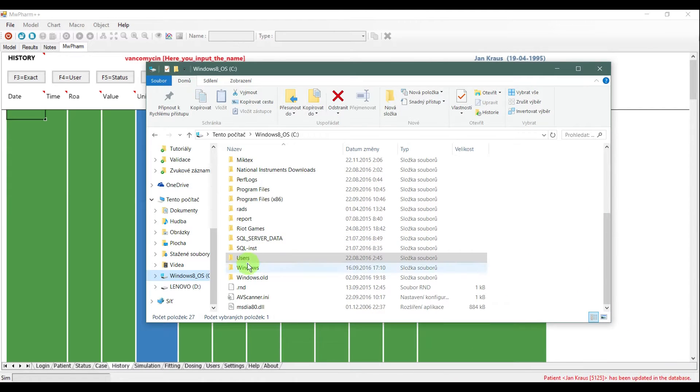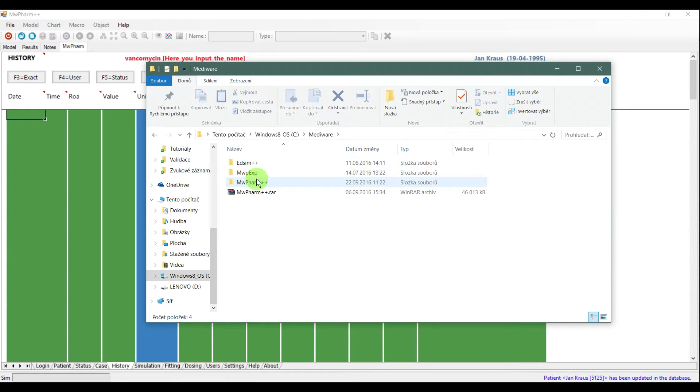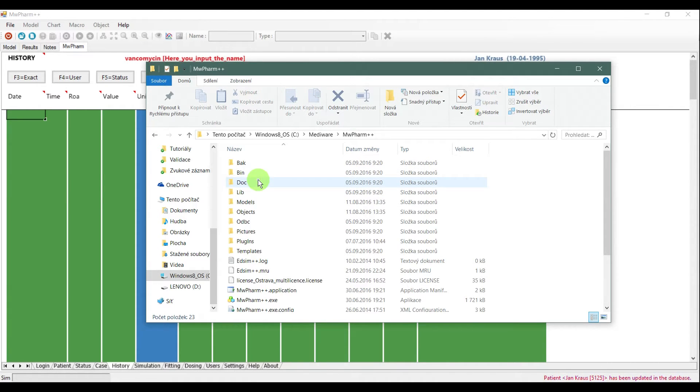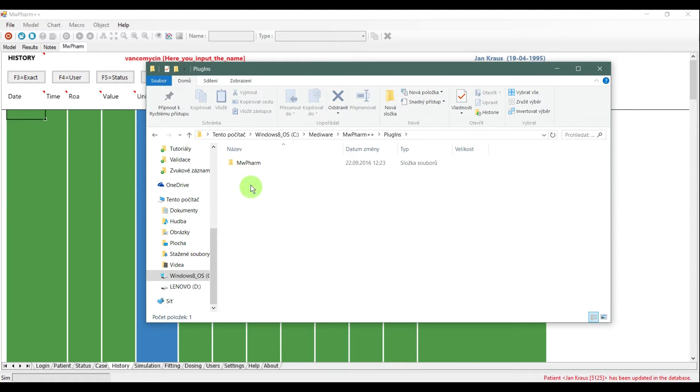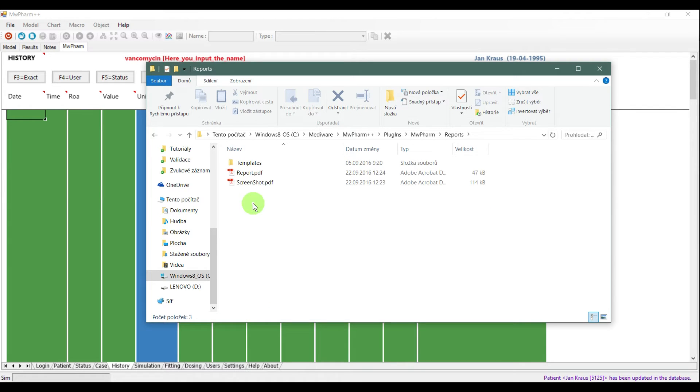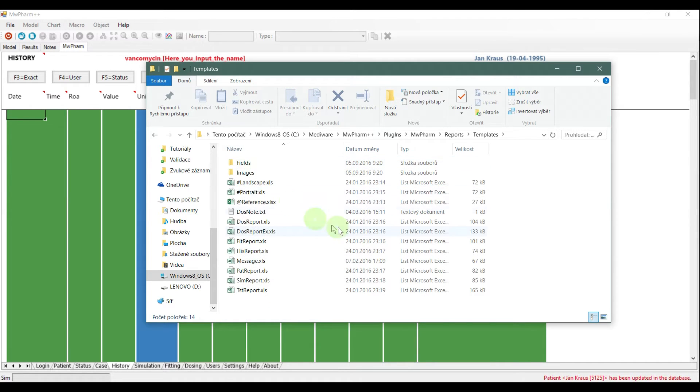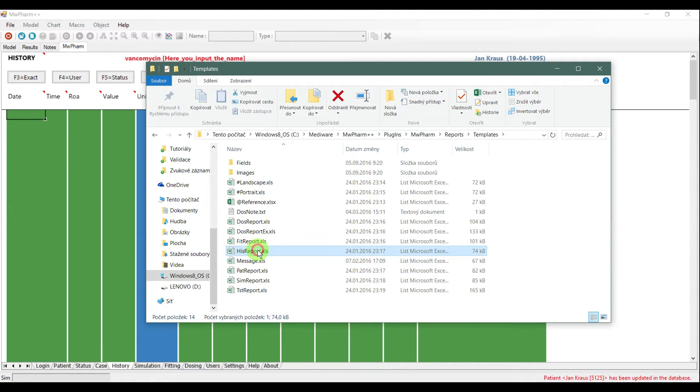Changing the reports is a little bit difficult. So, if you think you can't do it, write an email to us and we will create a report just for you. To change the report, go to the directory where the MWFarm++ is installed and go to the directory as shown in the video. Here, you have reports for all the tabs. Choose a report you want to change and open it.